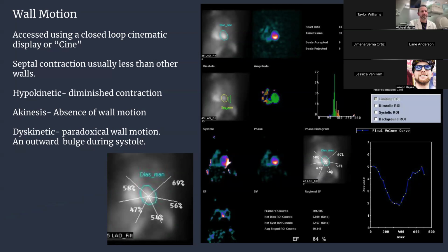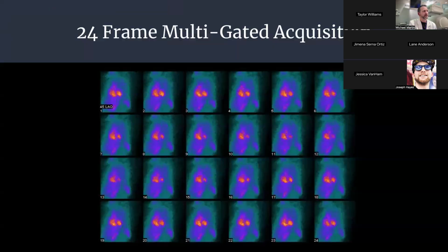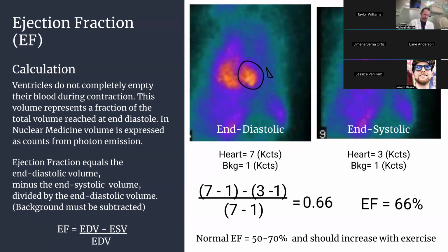I was wanting to know, considering that this can be done planar or SPECT, but it's typically done planar, is there a specific K count amount for each position, or is it a timed amount, like 5 minutes or 500 K counts? You can do both. Your computer should give you an option to set up K counts. Keep in mind that if you're setting up K counts, it's possibly going to limit the number of frames you can get for the time. Usually when you're thinking of getting a static image, you either throw it on K counts, or on time, or sometimes whichever comes first.